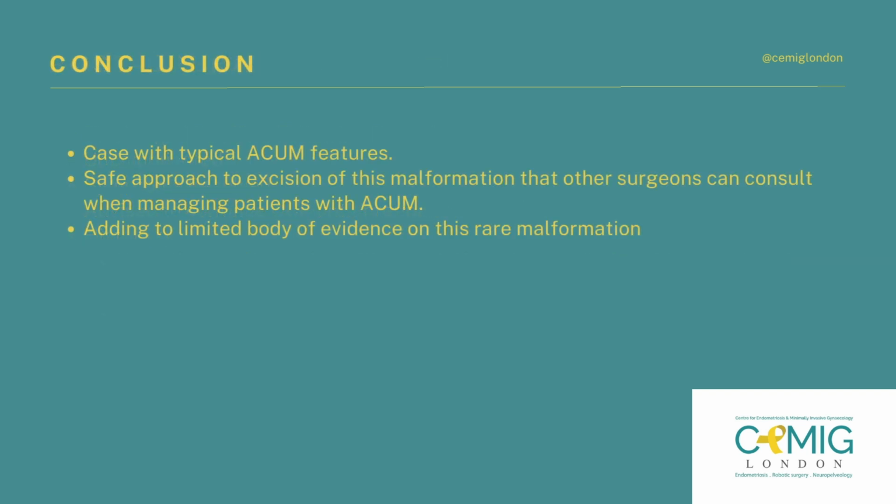In this case, we've aimed to describe a presentation with typical ACUM features, and a safe approach to excision of this malformation that other surgeons can consult when managing patients with ACUM, and to add to the very limited body of evidence on this rare malformation.